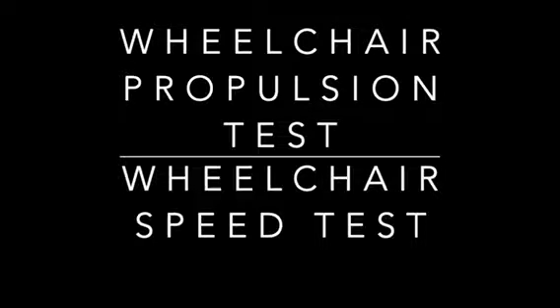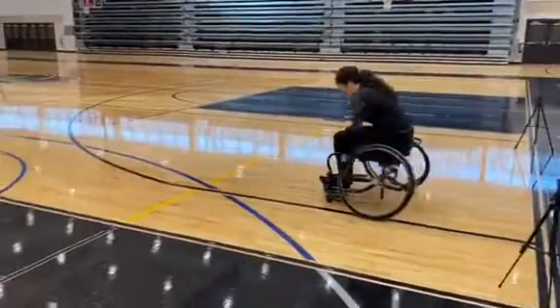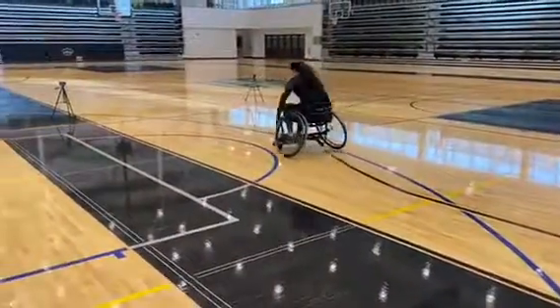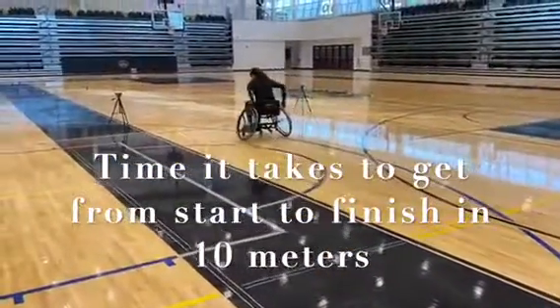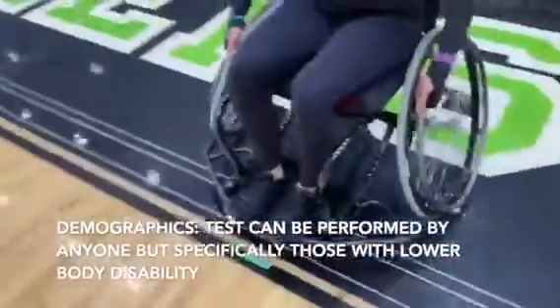easier known as a 10-meter wheelchair sprint. The purpose of this test is to evaluate wheelchair mobility, but for our purposes, I've modified this test so that our main focus will only be on the speed component. This test is intended for those who require a wheelchair.